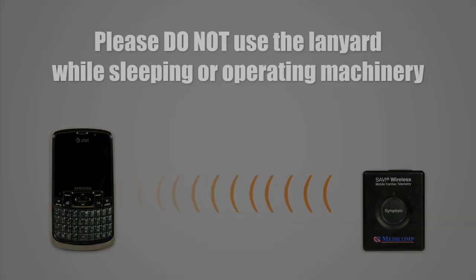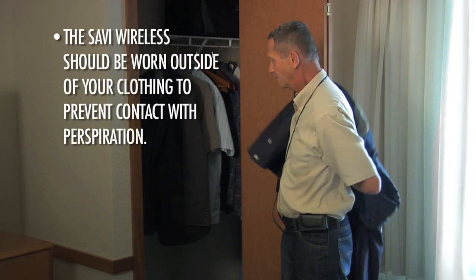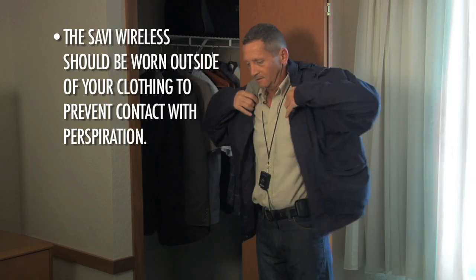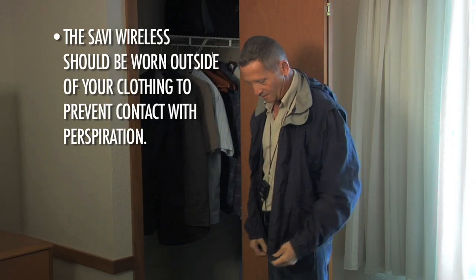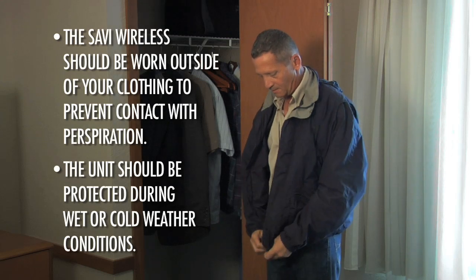Please do not use the lanyard while sleeping or operating machinery. A note of caution: the Savvy Wireless should be worn outside your clothing if there's any chance that perspiration might come in contact with the unit. The unit should also be protected during wet or cold weather conditions and during exercise.